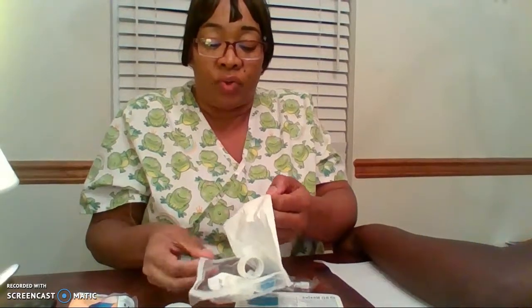So for the purpose of this video, I am going to start an IV on this gentleman, and you'll need an IV start kit. When you open this kit, you'll find the materials that are inside, and we'll go over shortly what they are used for. You'll need a flush. I'm just going to start a 20 gauge on this gentleman because he is 18 years old and healthy and has really good veins.